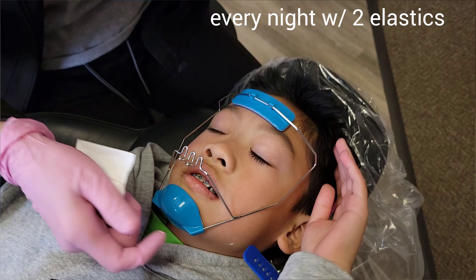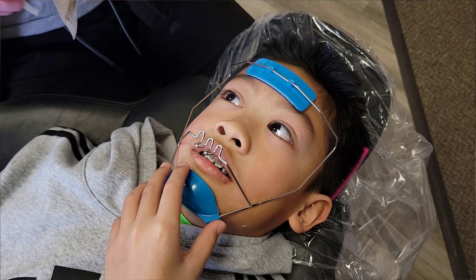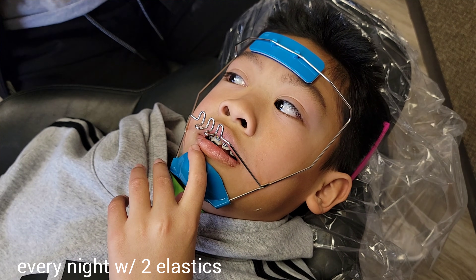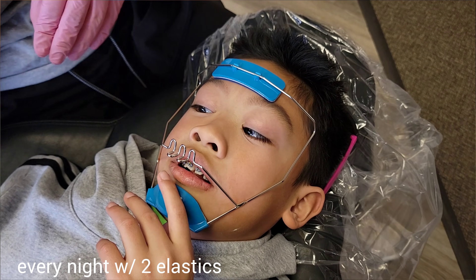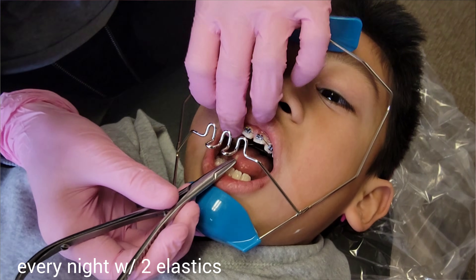So this is gonna sit on your face while you're sleeping like this. The first couple nights he's probably not gonna be able to sleep with it all night, just because it's new, it's different, it's gonna feel weird. And of course with this he's gonna learn to sleep on his back. So I have to sleep like this, Caleb. Okay, open for me.